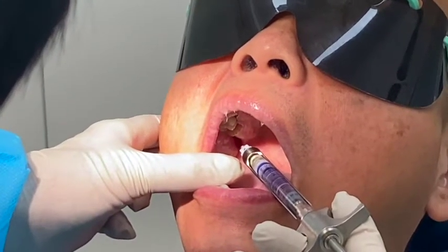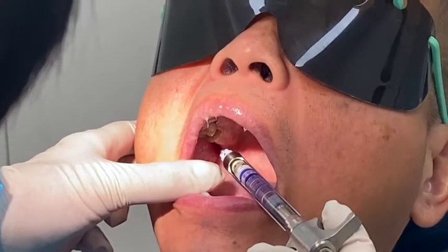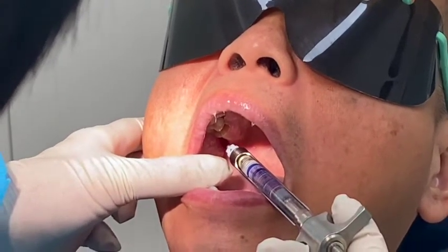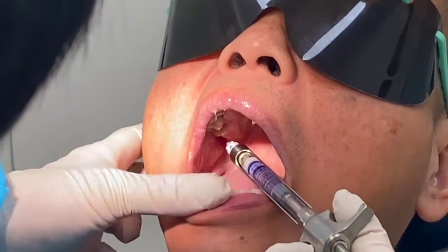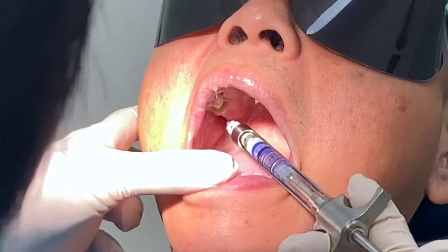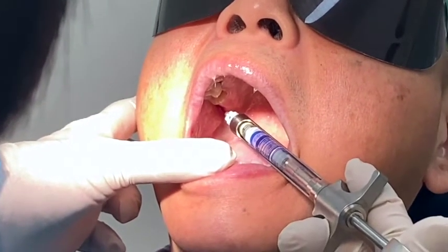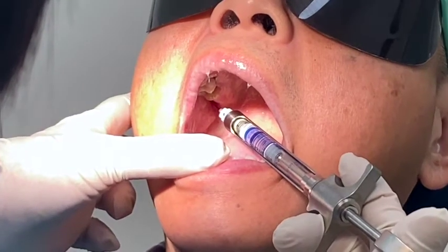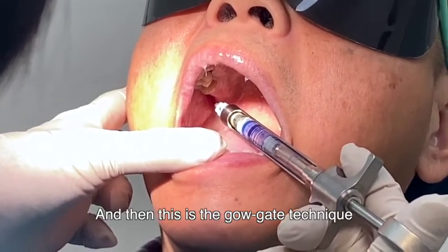Slowly, slowly. After you hit bone. And then this is the Gow-Gates technique.